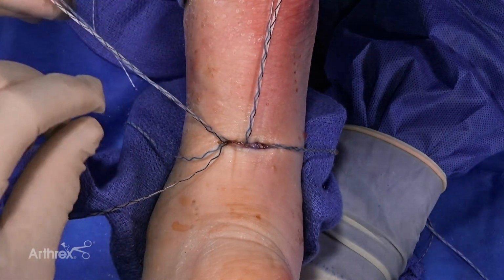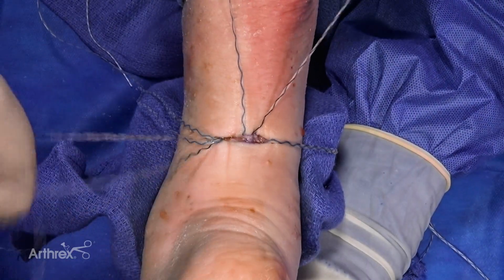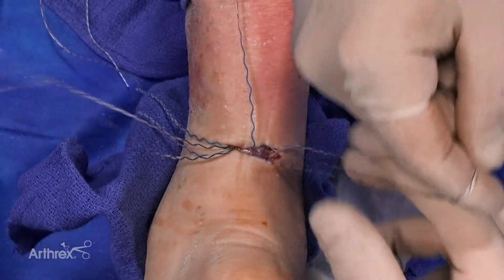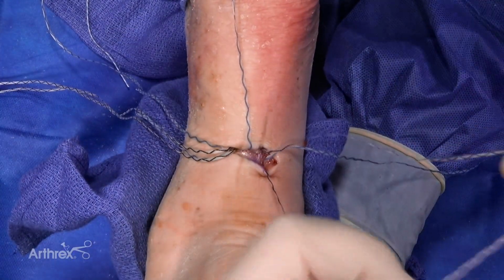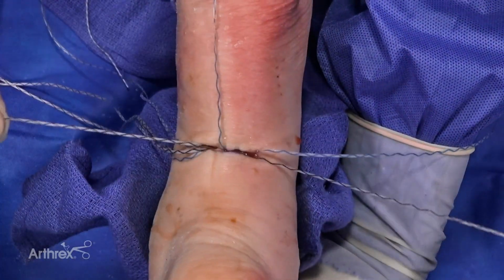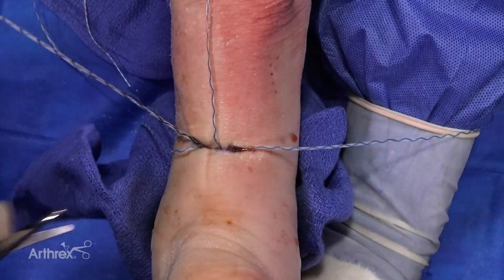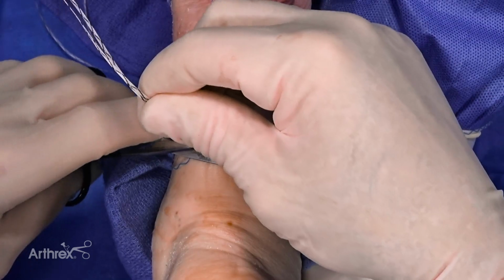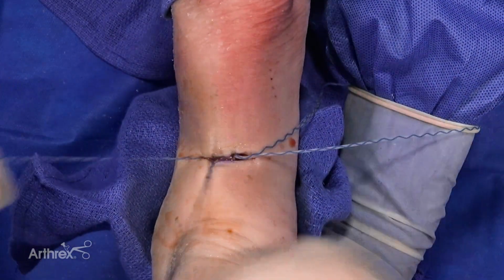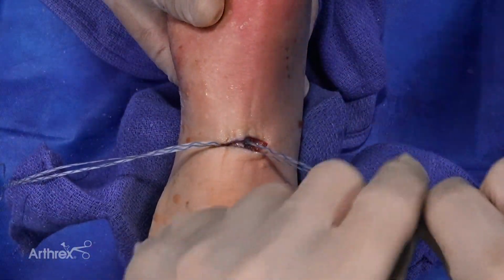Now I'll go to my other non-lock suture, which is the zebra, the black-white stripe. And we'll go ahead and secure that. But once it's secure on that side, then I've got a point of fixation to tension against. So we'll go ahead and tension that side. And then once down, you just cut off the redundancy. And then our last suture to address is the lock suture. So I'll really make sure I cinch that down all the way. And same for the last side.